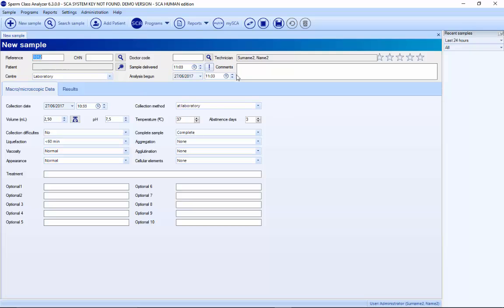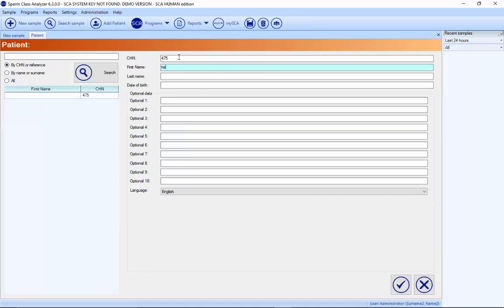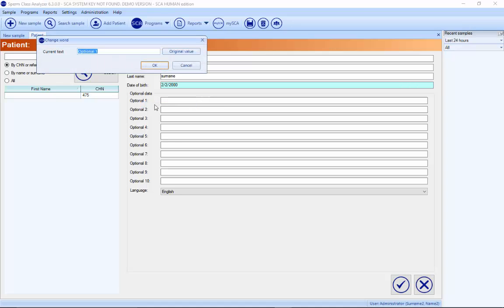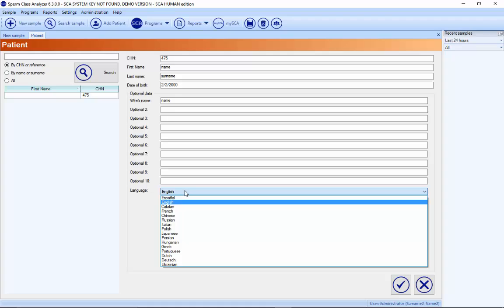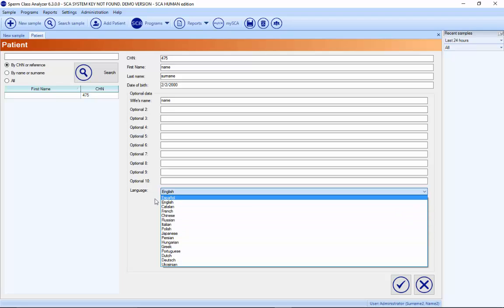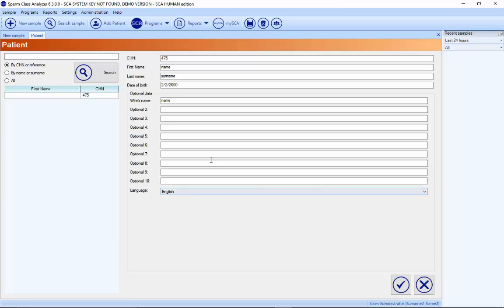Now we can go directly to create a new sample. Here we add a new customer ID. We can write the name, the surname, and the date of birth. In this version, there is a new feature: if you press with the right mouse button, you can change the field label directly. You can also add the wife name. All these optional fields are possible to customize. For each patient, you can select which language you want for the report, so each patient can have a different report language.